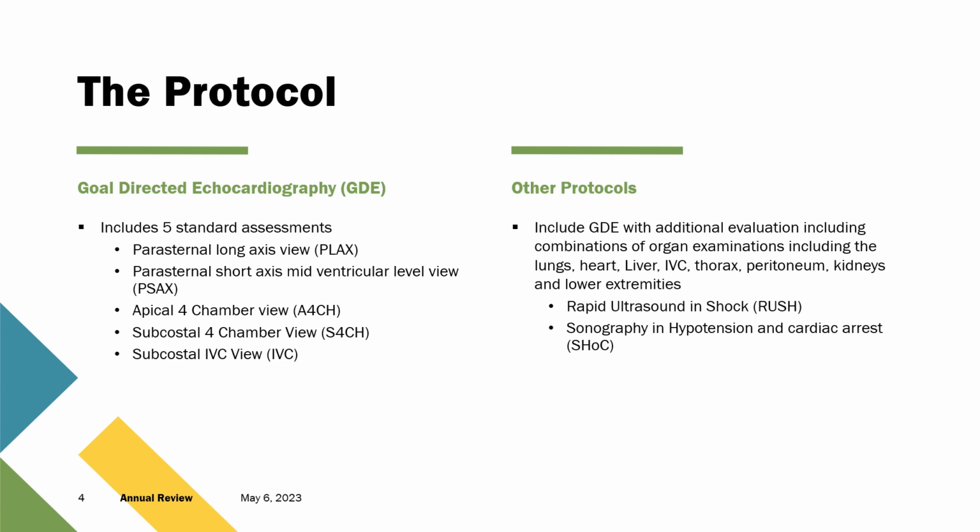Then you can go over to the patient's left side and evaluate for the apical 4-chamber view, and this is where you can see all 4 chambers, the mitral and the tricuspid valves, and assess it right in that region, and look for how efficiently those chambers are pumping and what the ejection fraction is, if you so intend.